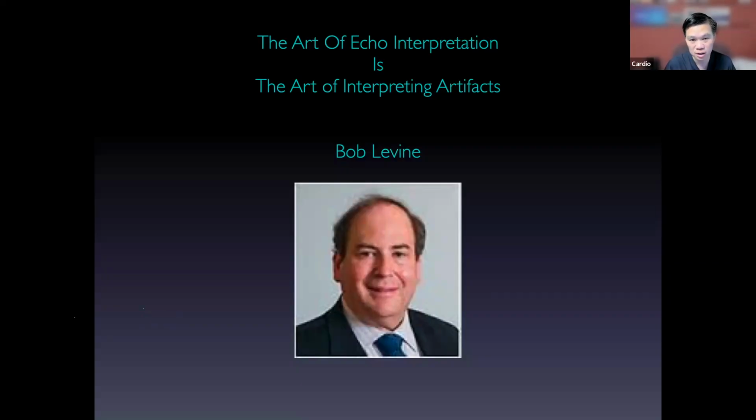And often the fellows in my generation, we called our Echo Fellowship a pseudo fellowship, because every week or every month we would come up with a sign that we call pseudo-MR or pseudo-wall motion abnormalities, etc., which you're going to hear more about.